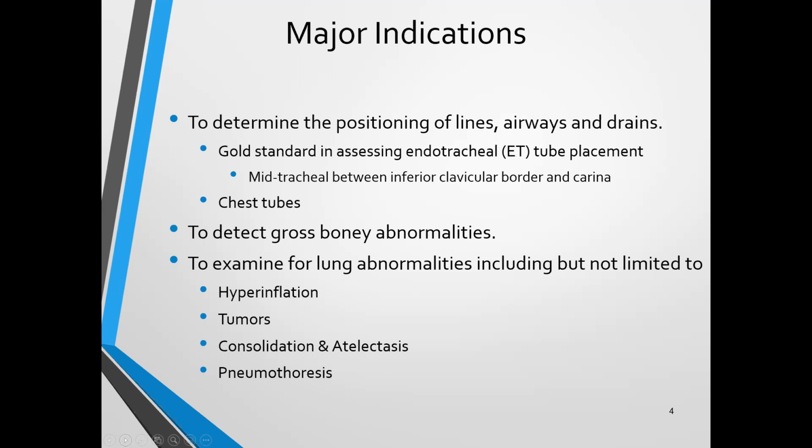Pneumothoraces is basically looking at pneumothorax, looking at the various forms of air that can accumulate outside of the lungs, but within the chest cavity. And we'll talk about some of the very specific types of conditions, three in particular. So in pneumothorax, but there are other related air leak syndromes as well.